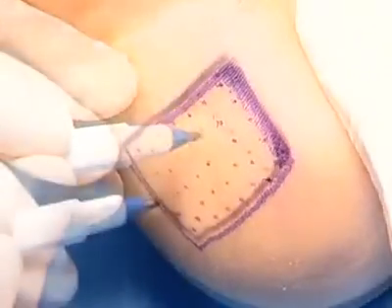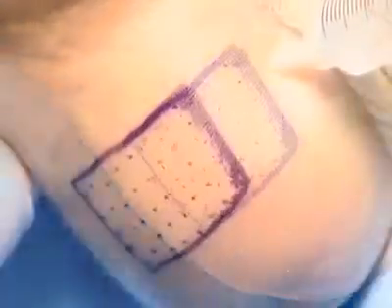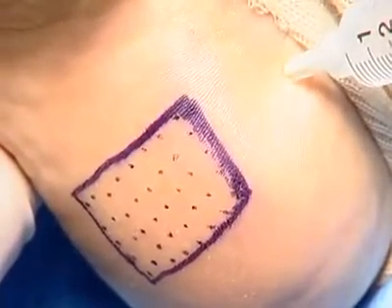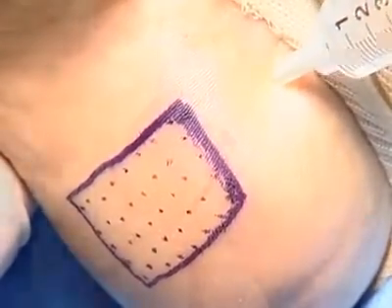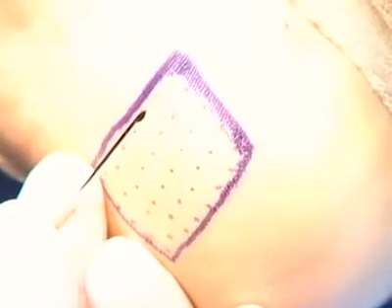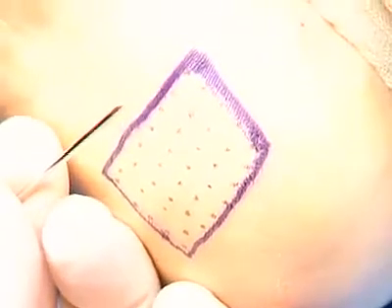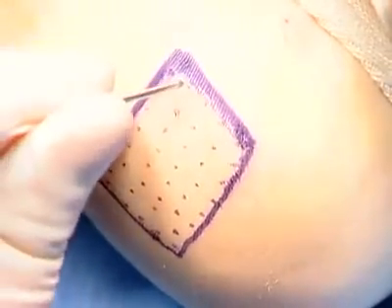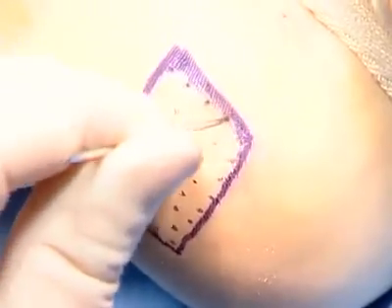Once the mapping is complete, the patient is brought into the operating room and intravenous anesthesia is utilized. Local anesthesia is utilized with 0.5% Marcaine to block both deeply as well as superficially to make sure the medial calcaneal nerve is addressed. An ankle tourniquet is utilized to create hemostasis, and then a .062 K-wire is utilized to create percutaneous incisions by penetrating the skin and then taking the incision superficial to the level of the plantar fascia. The plantar fascia is not penetrated with this K-wire.